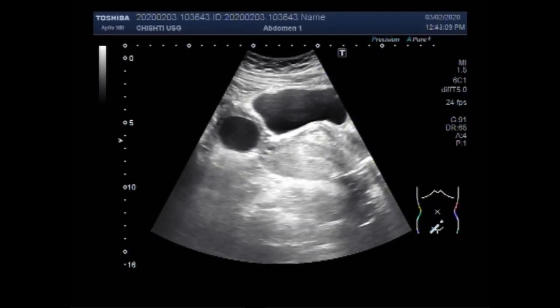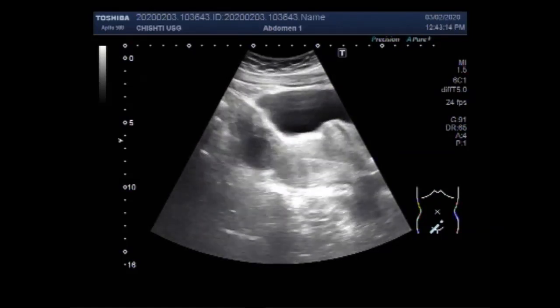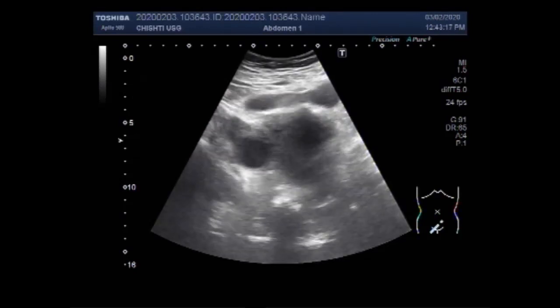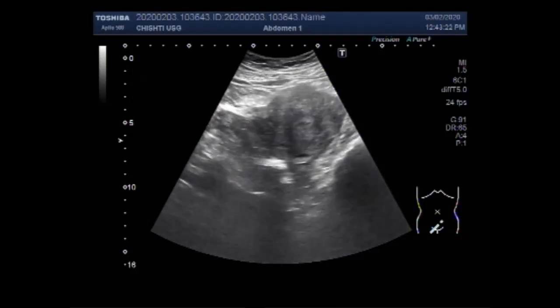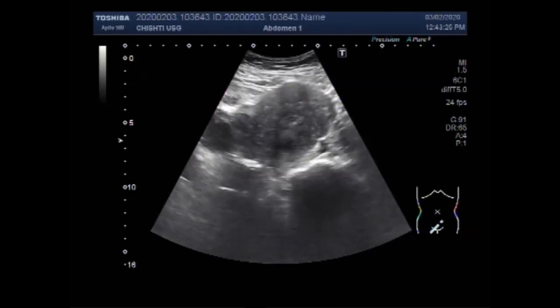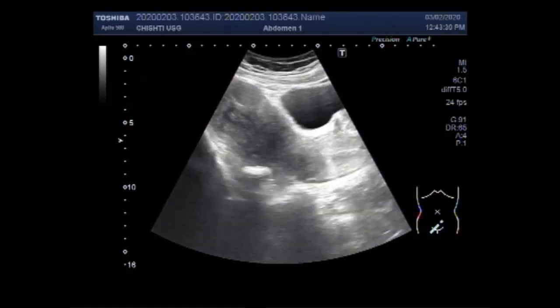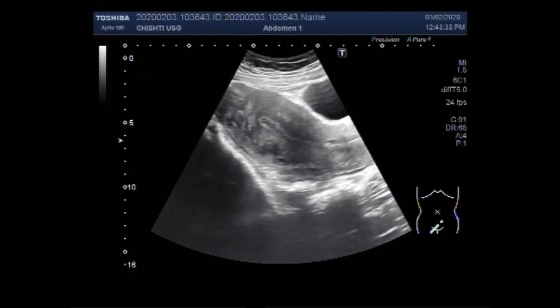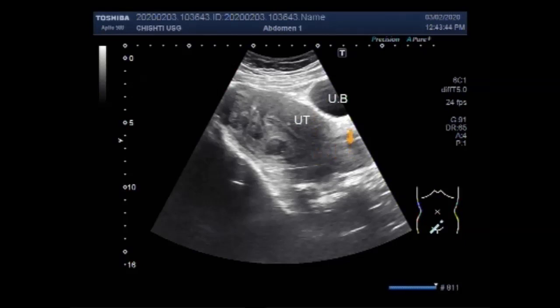Again you are going to see the urinary bladder, uterus, and a small ovarian cyst. Now you can see the uterus having multiple fibroids, and all these fibroids are adjacent to the posterior wall of the uterus. This one is the largest of these fibroids.